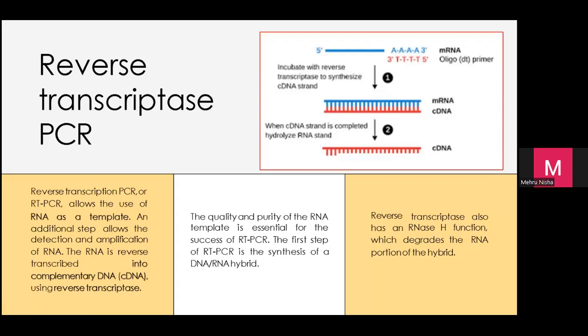So the challenges in this, kalau anda tengok DNA dia stabil sebab dia double stranded. You can even kalau terlupa letak di bench, tak letak di -20 pun, next day you come, it will be stable. Even after 1 week, it's still okay lah.